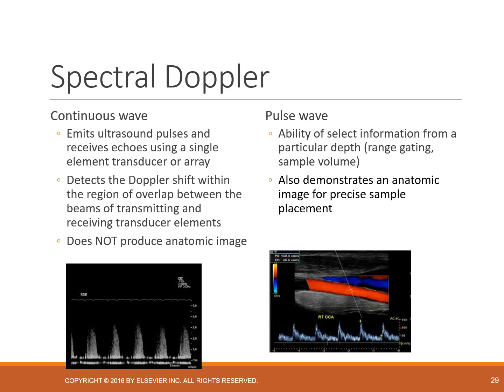That brings us to spectral Doppler. So spectral Doppler is basically this display of the waveform. It's our visual representation of how blood is moving through the system. We have two different options for spectral Doppler. Continuous wave is usually only used in echo, for the most part, or some more intricate vascular imaging, but pulse wave is going to be used very, very frequently. So this is probably where most of our focus is going to be.